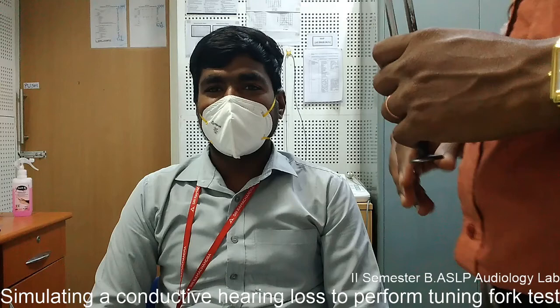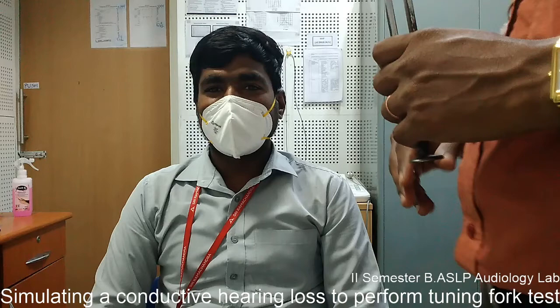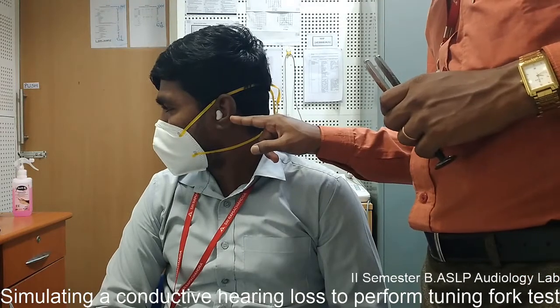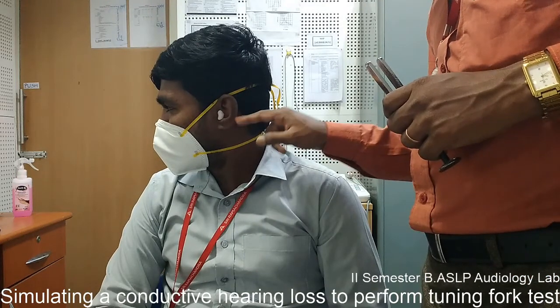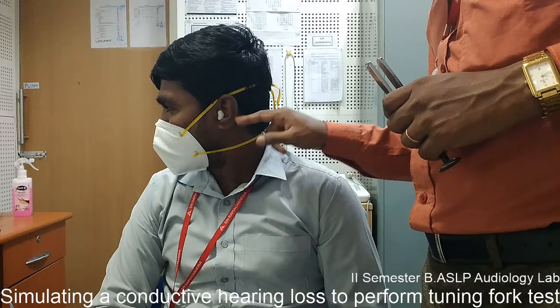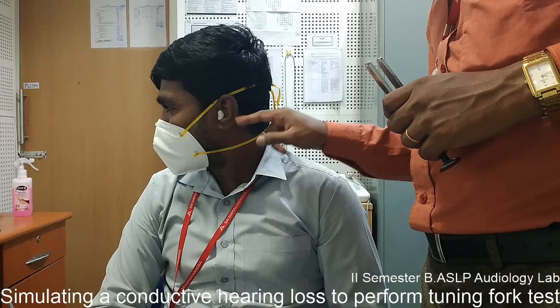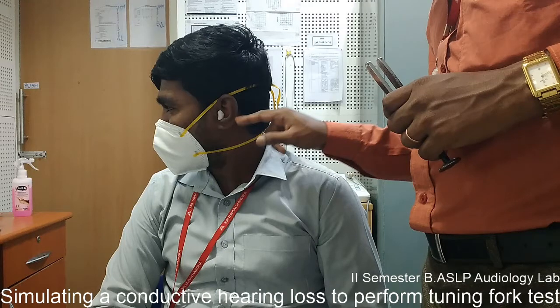In this video we will discuss how to simulate a conductive hearing loss in order to perform a tuning fork test. The subject's ear canal is occluded with a piece of cotton. The cotton is rolled and completely occludes the ear canal in order to simulate the conductive hearing loss.